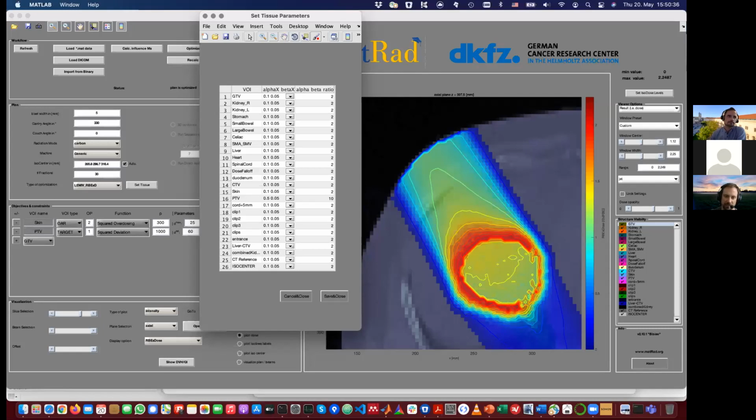Or like here in particles, where it's the RBE weighted dose, where you try to mimic photons because you know all these processes from the photon world. So if you know a fractionation level and some alpha beta values and the prescription, you try to do an RBE weighted dose and then you basically relate to what you know from the photon world. So that's maybe not a satisfying explanation, but maybe that was clear enough and understandable.